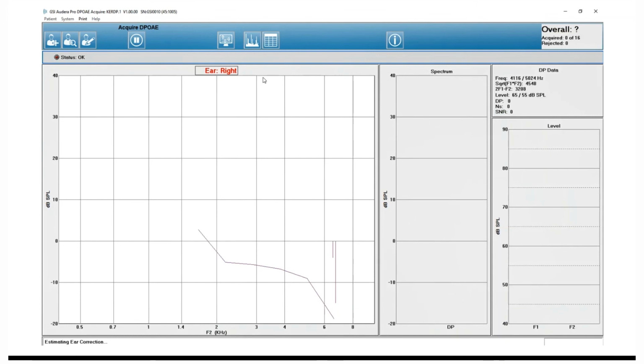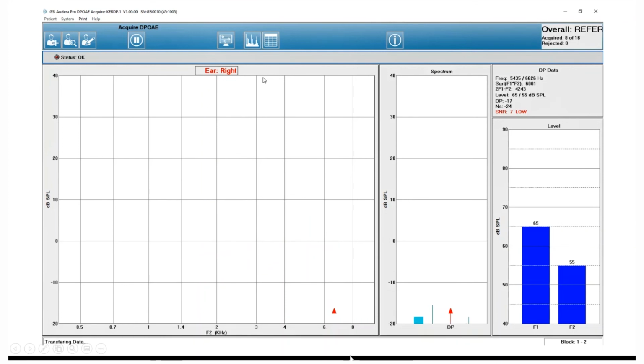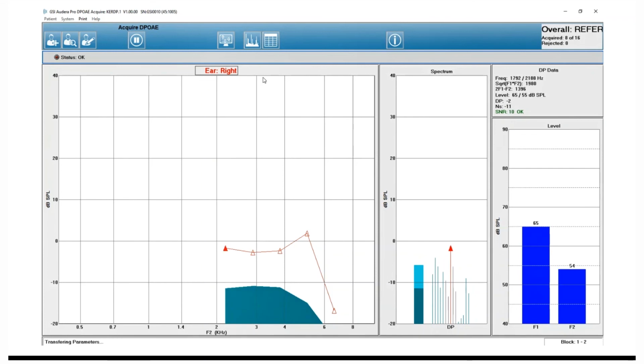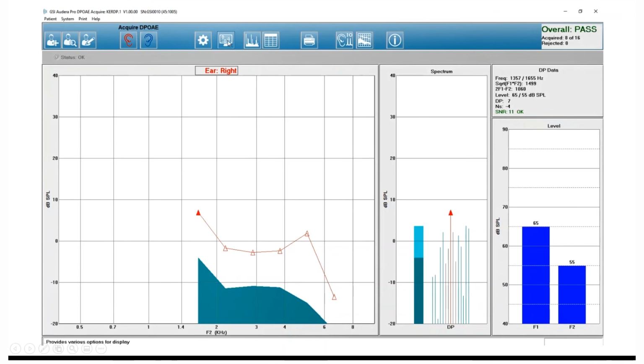So the first thing that happens is a measurement of noise, then the in-the-ear correction, that's the calibration, and then the test is going to start. This is the 6-frequency protocol. It's going to start in the high frequencies, so all the default protocols that are included begin in the high frequencies, but you can customize that. Dark green is noise. Red triangle is the response in the right ear at each frequency. And if it's filled in red, then that's a response. The data for that data point will show in the spectrum and DP data areas.